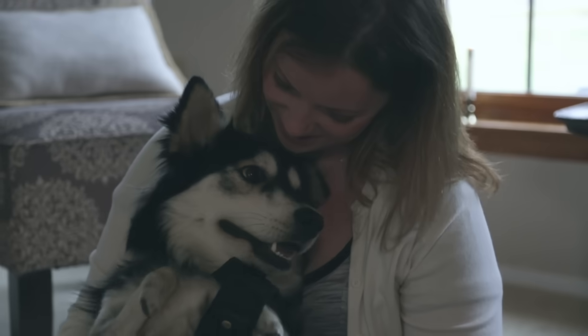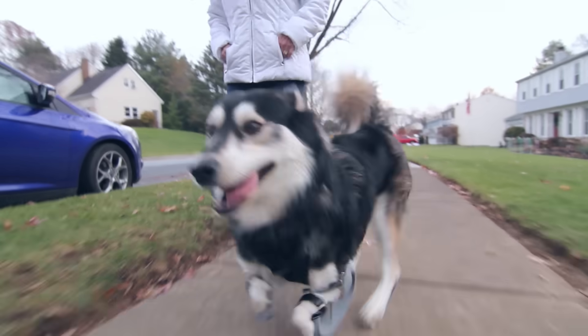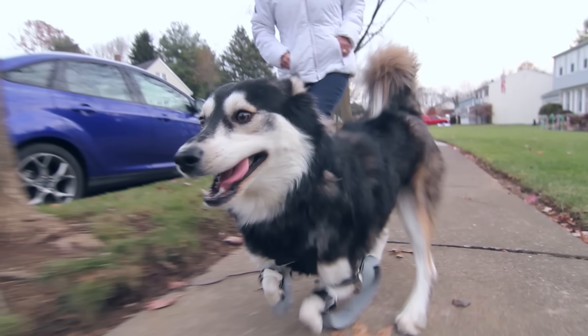This is what 3D printing is all about — to be able to help anybody, dog, person, whoever, to have a better life. There's no better thing to be involved in.